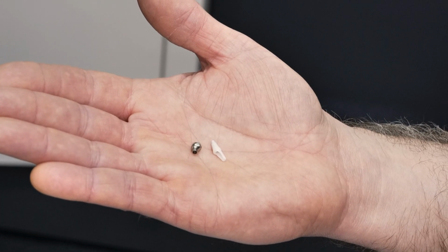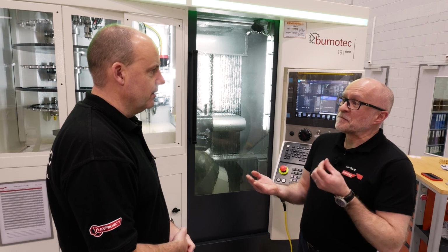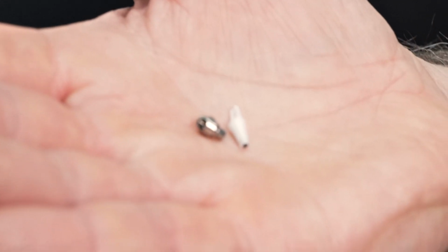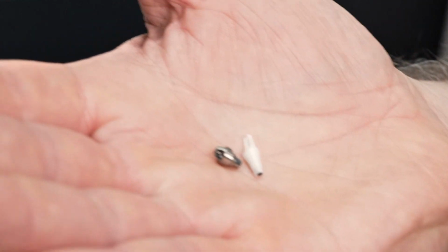They'll screw a dental implant into your jaw. They'll fit an abutment on top of it, the ceramic tooth on top of that, and screw the whole thing together as an assembly, if you like. And here's two abutments, is what we're saying here. So what else is in this family? So these are the abutments.